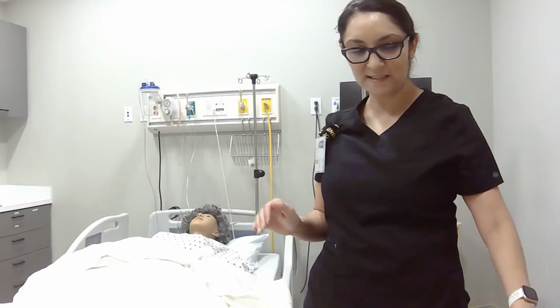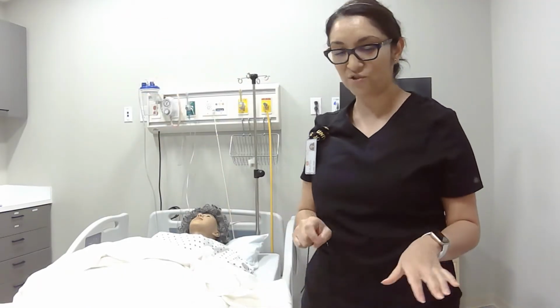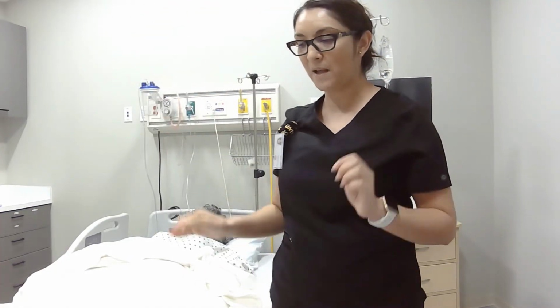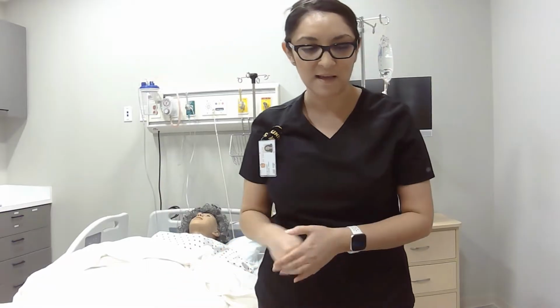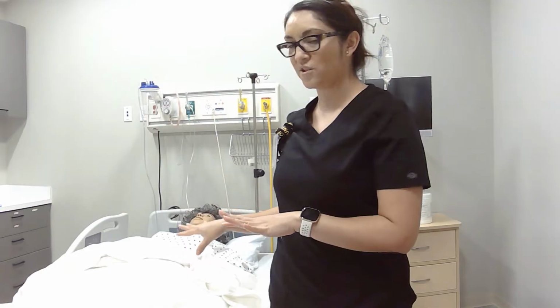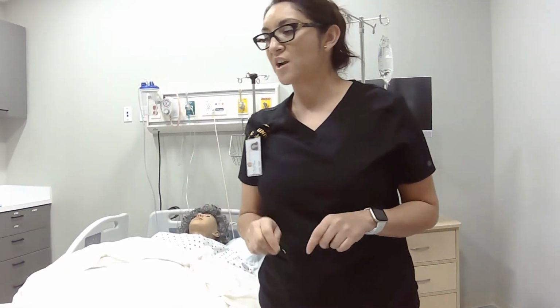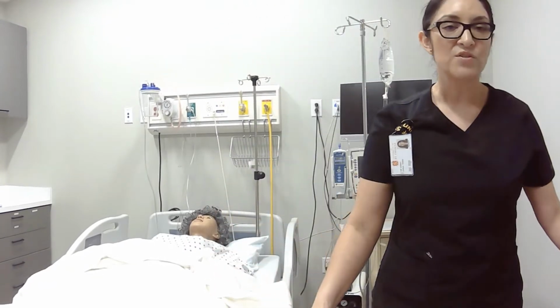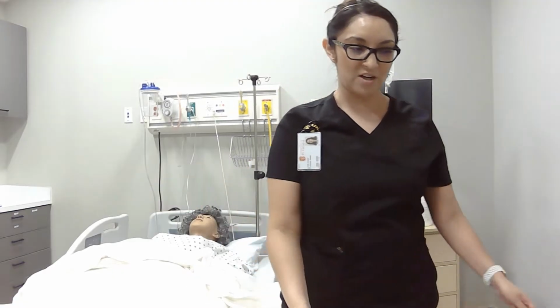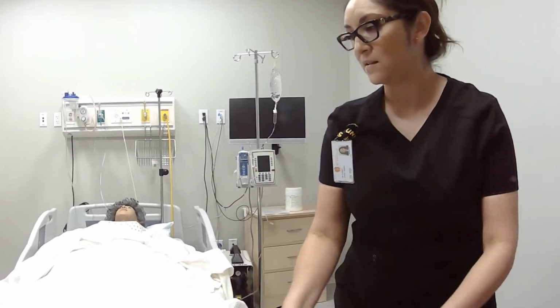So once we have our patient identified, we're going to provide privacy, so close the patient's room. Some rooms may have a curtain, so you can put the privacy curtain, because you are exposing the patient. So you want to make sure that the patient has all the privacy in the world. I need to make sure that my trash can is nearby. So I am right-handed, so I'm going to go on the right side of the patient, and to be able to do all of this.